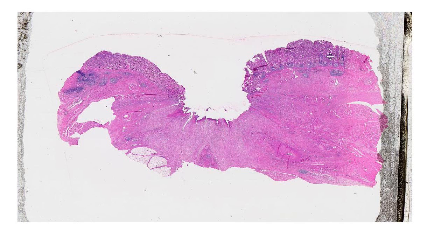Let's go over them here in this more preserved area. We have the mucosa, which is composed of 3 parts. We have the epithelial cells, the lamina propria, and the lower boundary is the muscularis mucosa. That's this wispy muscle layer right here. Beneath the mucosa, we have submucosal tissue. And the 3rd layer is the muscularis propria. That's the 2 muscle layers of the GI tract.